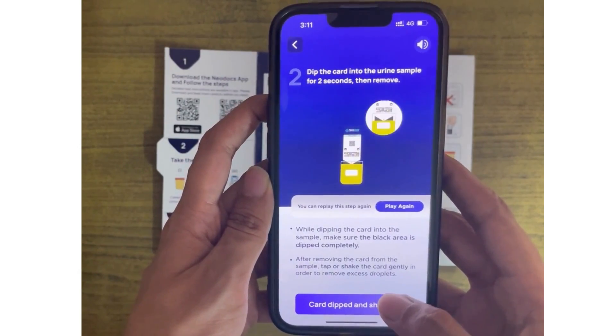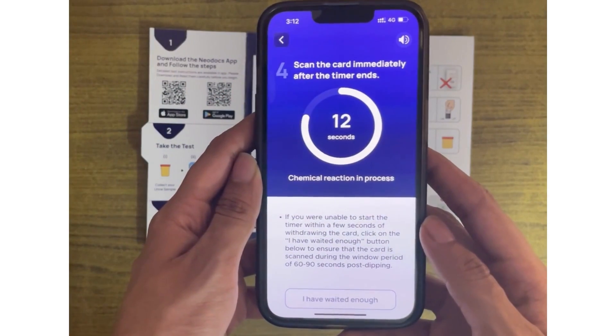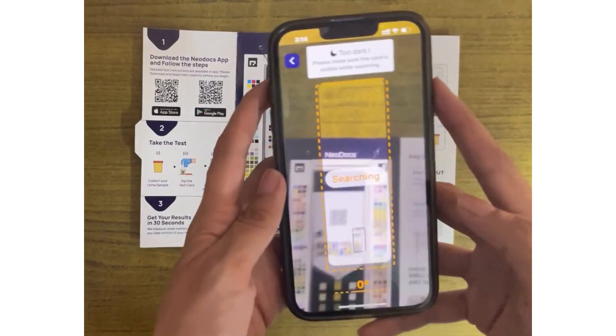Follow the instructions on the Neodocs app and start the 60-second timer that's present in the app itself. Wait for the entire 60 seconds. Do not skip the timer. Click the photo immediately after the timer ends.